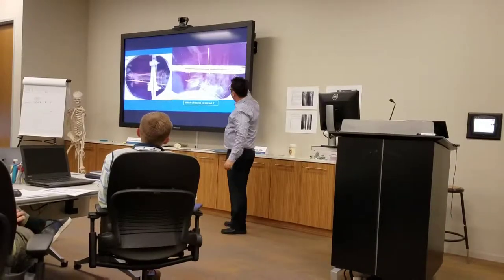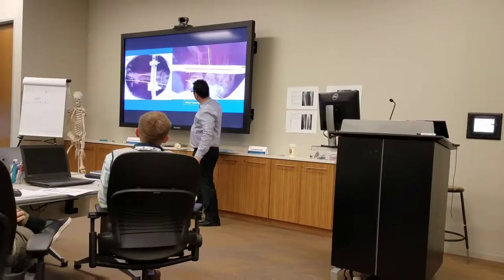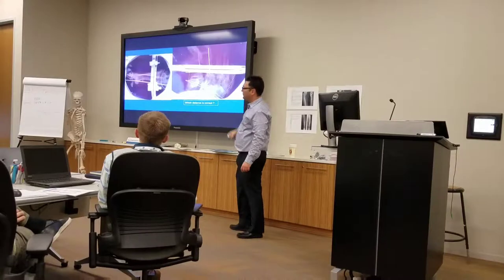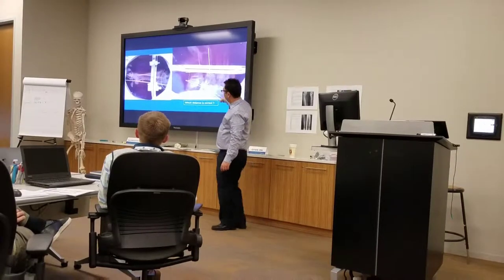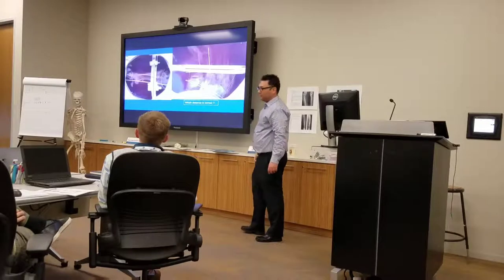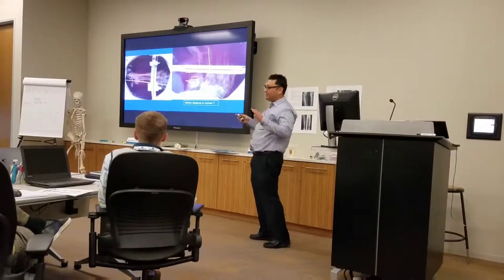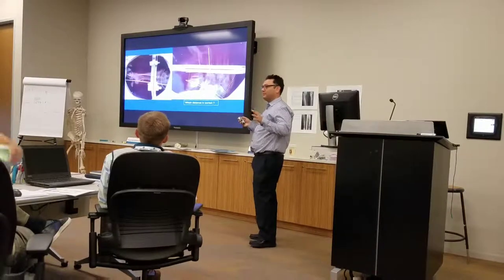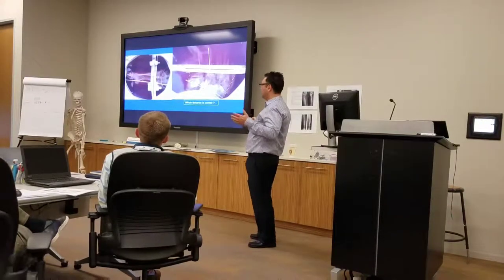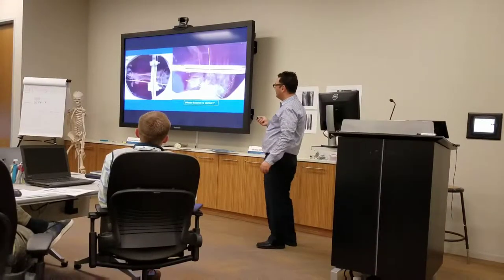You have to realize that the osteotomy is over here, the osteotomy is over here, and the osteotomy is over here. So the question is, where do you measure from? Because this is a much larger distance from here to here, than from here to here, than from here to there. Center, right. So just keep that in mind. These are questions that may pop up, where people are going to say, "Hey, wait a minute. What's considered the center of the osteotomy?" So keep all these things fresh in your head.